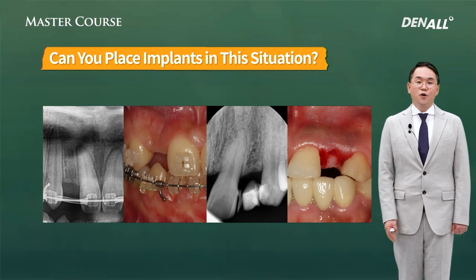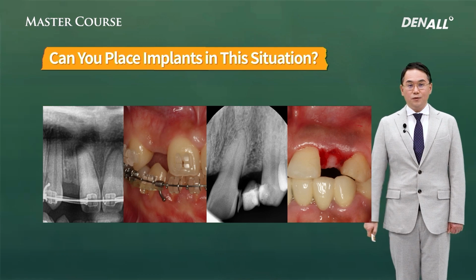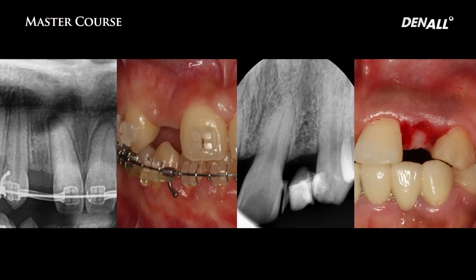Clinically, if I encounter a case like this, we are reluctant to place implants here. Can we place implants in these patients? In the maxilla, the lateral incisor can be congenitally missing. Then this is the situation. Mesiodistally, it is limited and the bone width is very narrow, and the direction of the root is unfavorable for implant placement. The OneMS system is designed to overcome this problem.